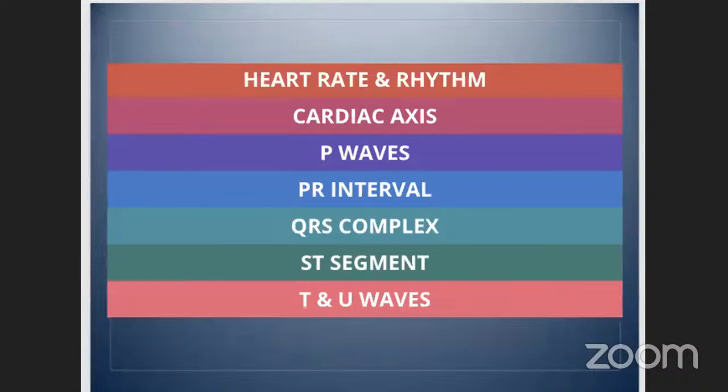This is from Geeky Medics. Geeky Medics is a UK-based institution, and they do a lot of teaching targeted at undergrads and early postgraduate doctors or practitioners. This is a very structured approach, and useful to us because as we forget how to interpret different things, if we just stick to a basic diagnostic algorithm rather than focusing on different abnormalities or what we don't know how to interpret, we can get through to a lot of the juice and make clear management decisions on the basis of sticking to that.